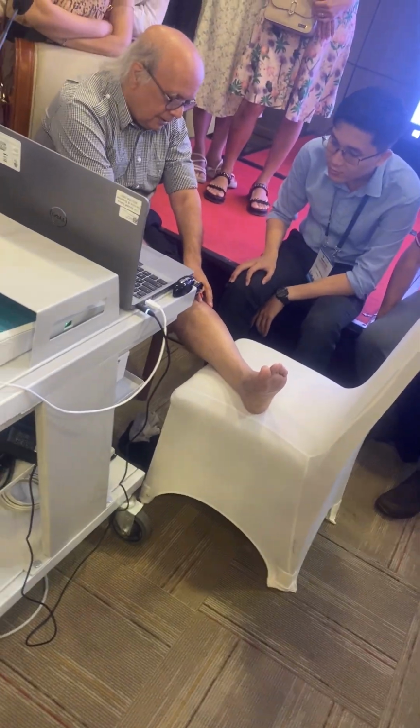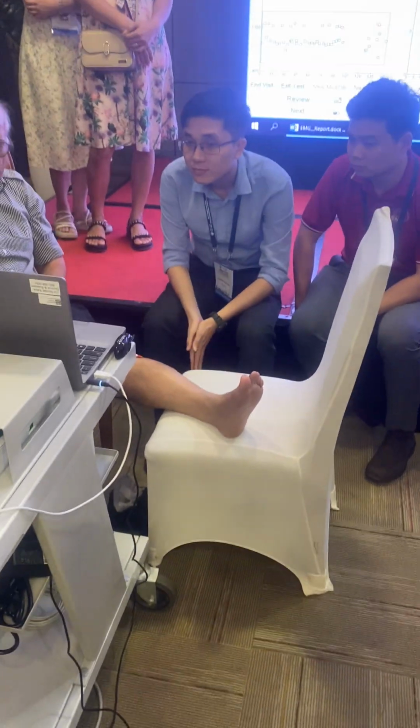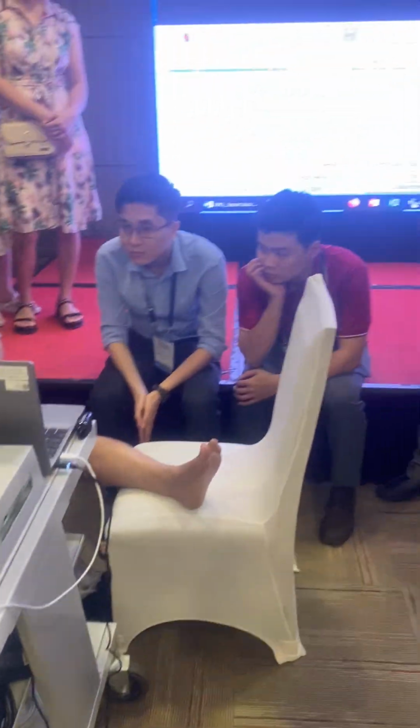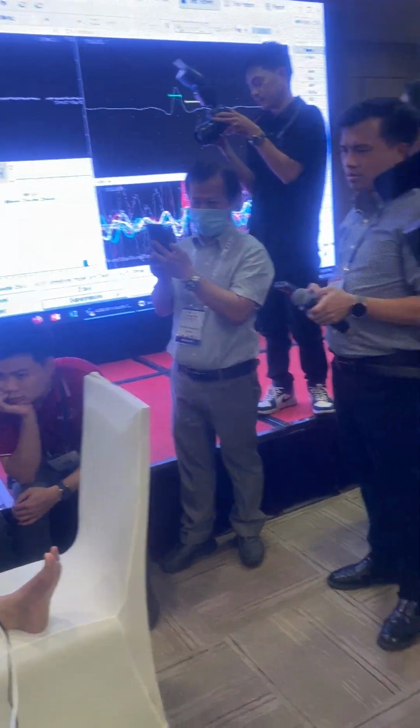And you insert it. Okay. The next thing, we need to listen to the sound. Okay, so I'm going to turn on the sound.